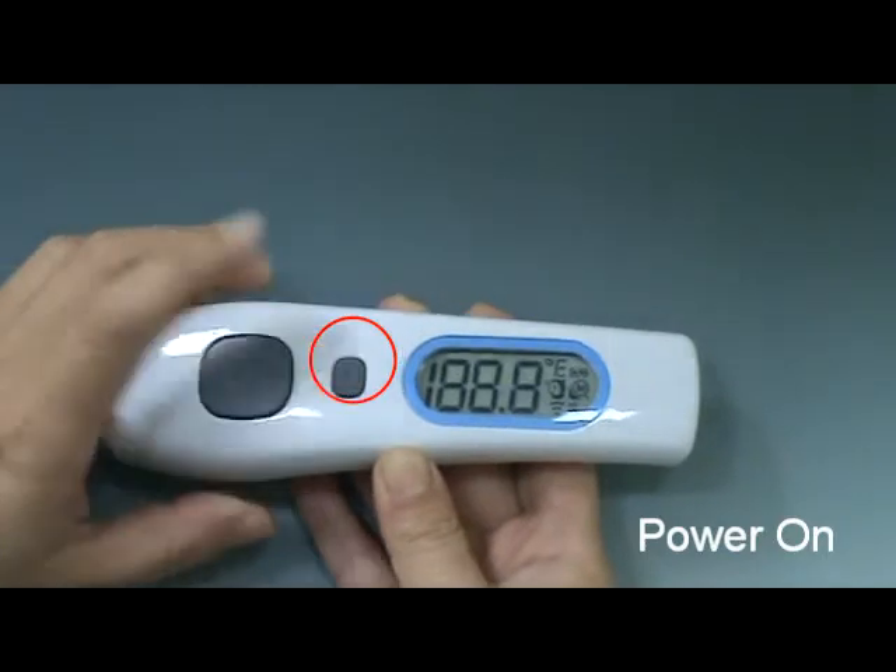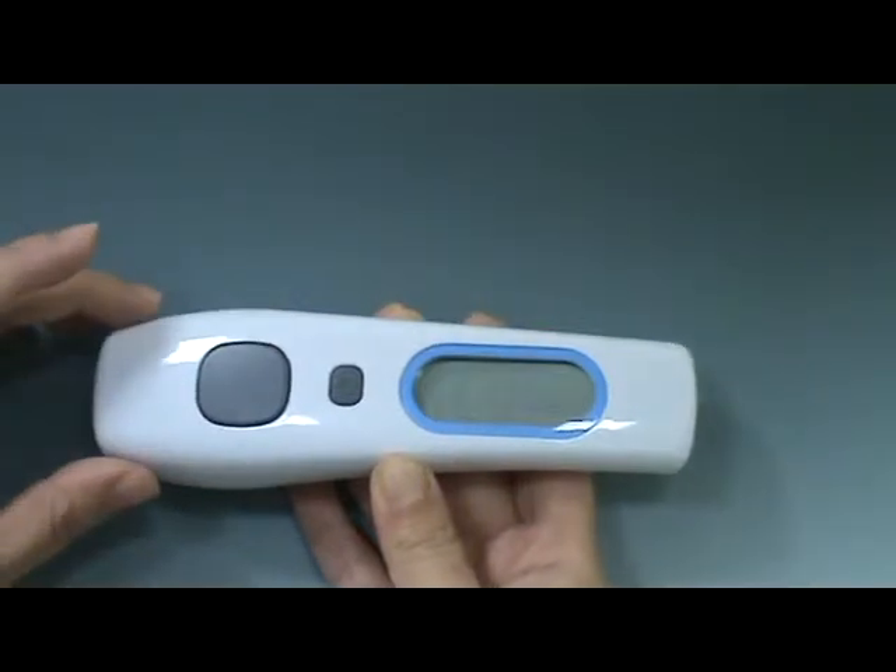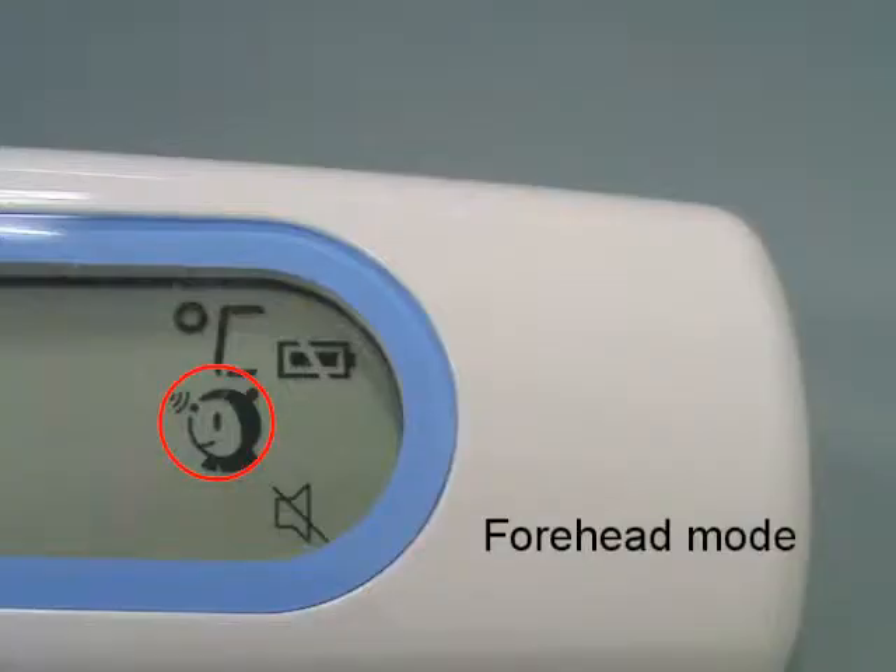Press the main button to switch the thermometer on. The thermometer performs a brief self-test. All elements of the display are shown on the screen and you will hear a 2-beep sound. Forehead mode is the default mode.